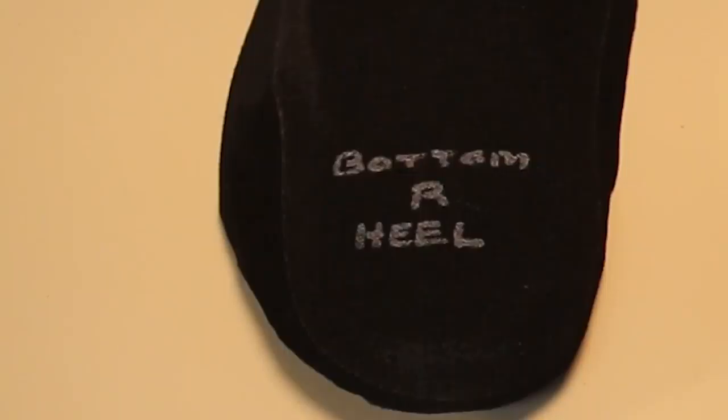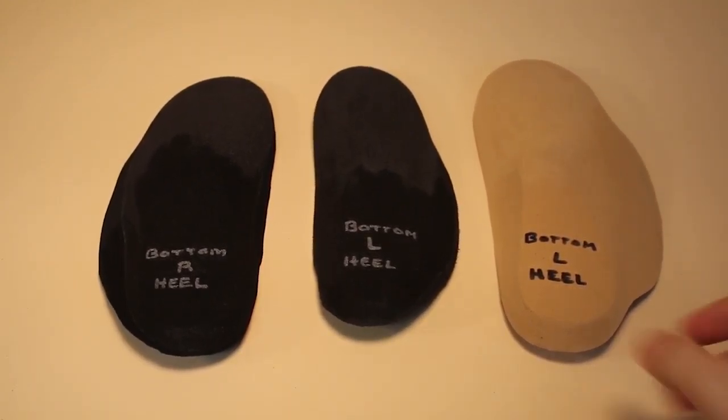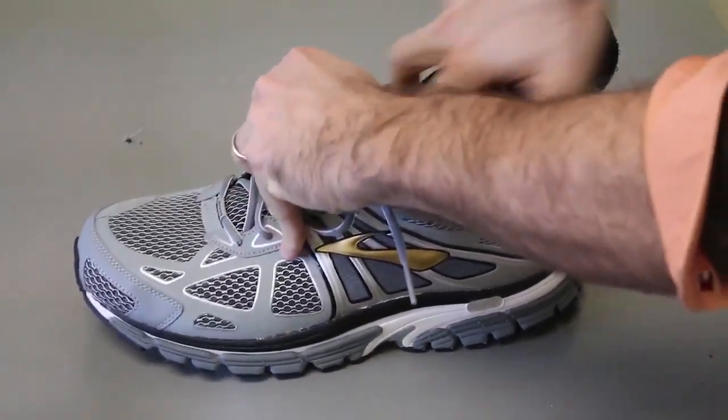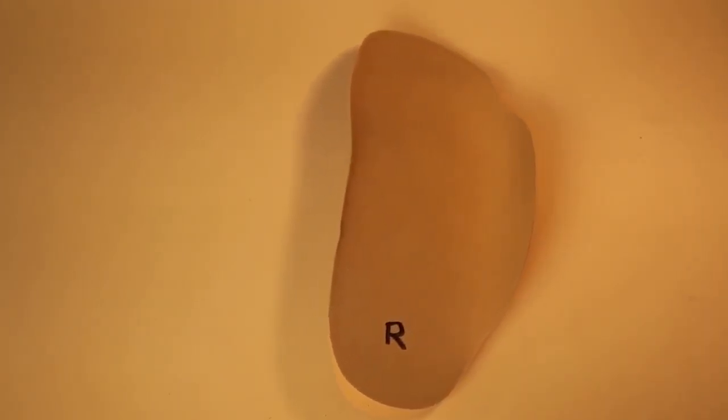Note the label: bottom, R or L, and heel. This label on the bottom of the orthotic indicates which device belongs to which shoe. This must be face down in the back of the shoe. Sometimes we will additionally indicate the right or left on the top, but then we usually only write the L or the R, and not the word heel and not the word bottom.